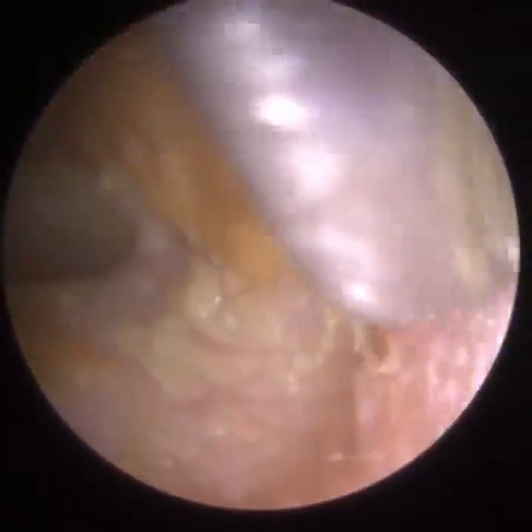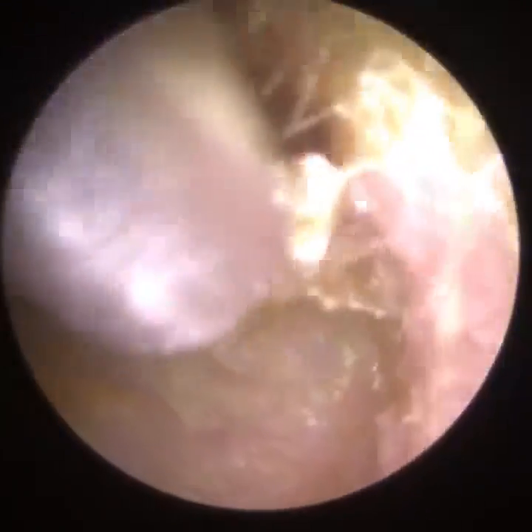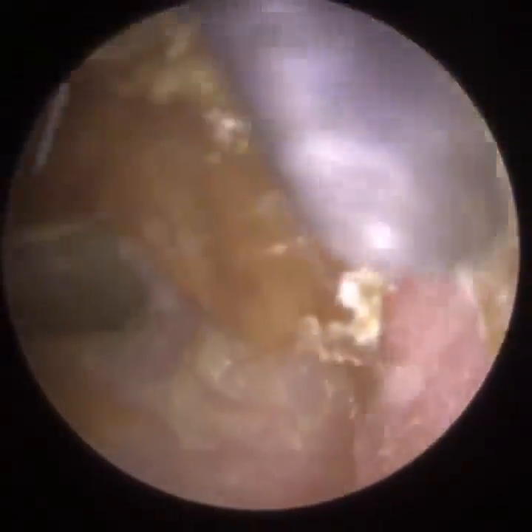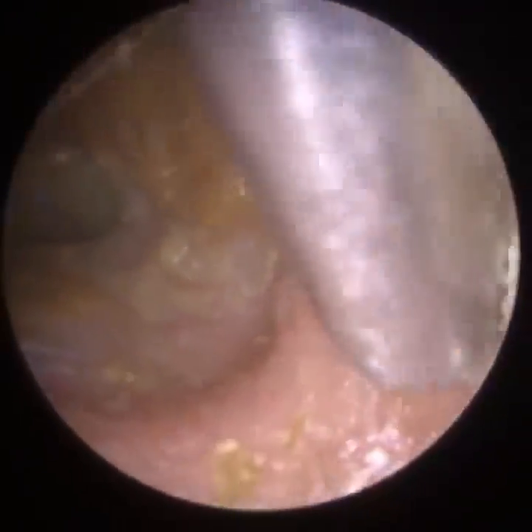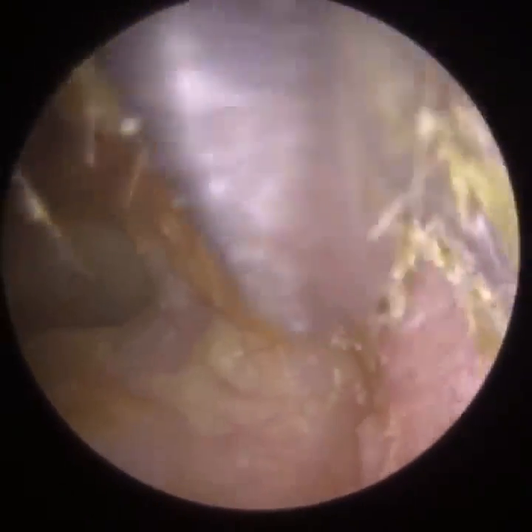We're just trying to remove all this dead skin, crystallized otter ear, so crusted ear discharge basically, off the ear canal. Now, it's very difficult because the outer third of the ear canal is cartilaginous, so we can apply some pressure like we are here. But when you get to the inner 2/3 of the ear canal, it's very sensitive.